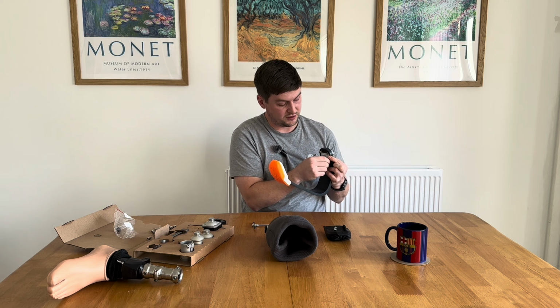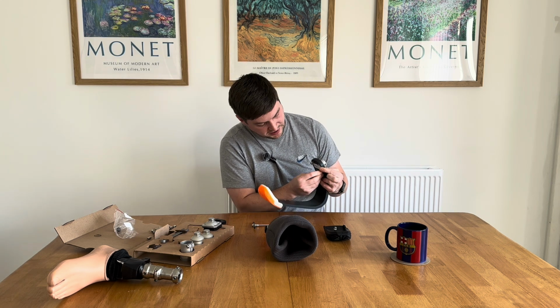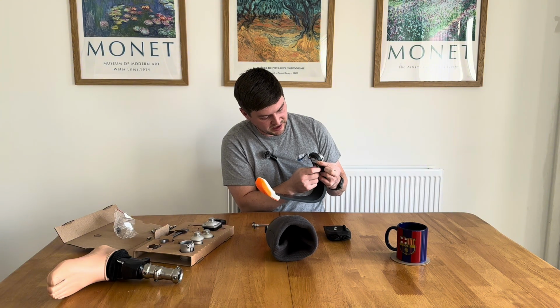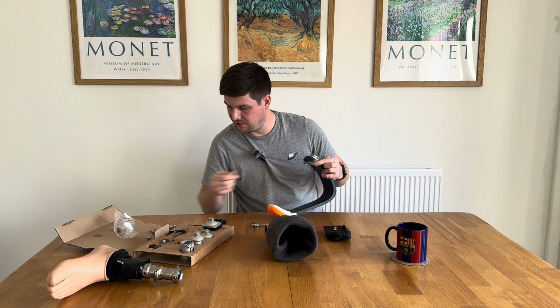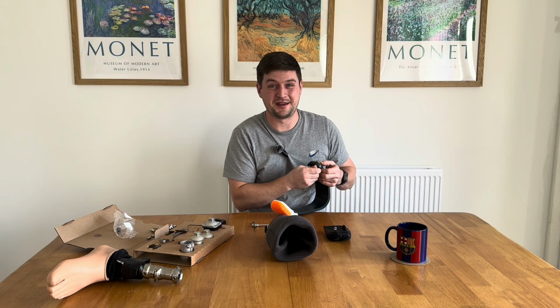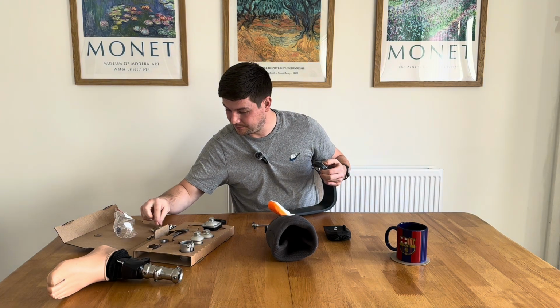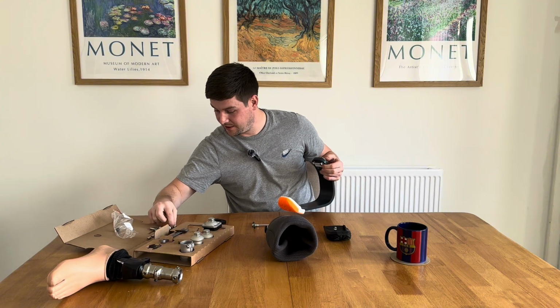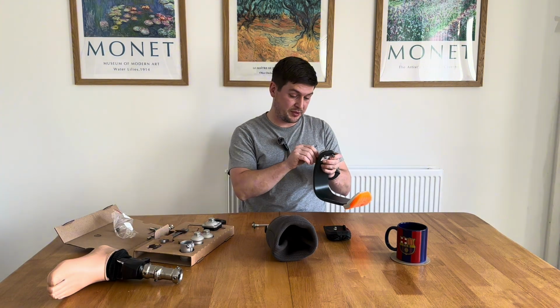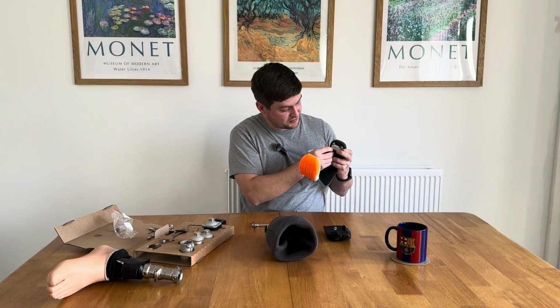I'll probably fast forward some of this, to be honest. I'm surprised you don't get washers. I'm surprised you don't have to put a washer between this nut and the blade. But obviously not. Just got to make sure that these nuts and bolts are as tight as when I undid them. Because obviously, like I said, if it was running and this falls apart or something, I've got no one to blame but myself. So I'm just going to put that out there.